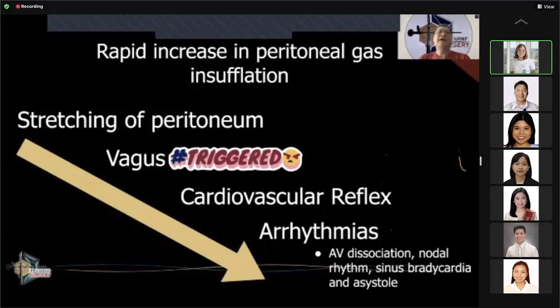So why do you need a high insufflation rate? Because during surgery, there are smokes, there are plumes that develop in the peritoneal cavity, and you want a clearer image of the intra-abdominal cavity. You remove the air by opening your trocar. So if your pneumoperitoneum flow rate is low, you cannot actually create a working space. You need a faster flow rate, around 30 liters per minute, to maintain your working space.